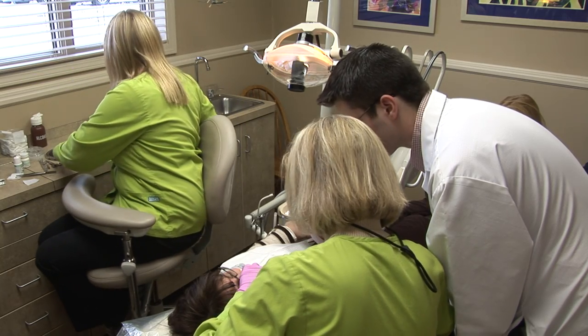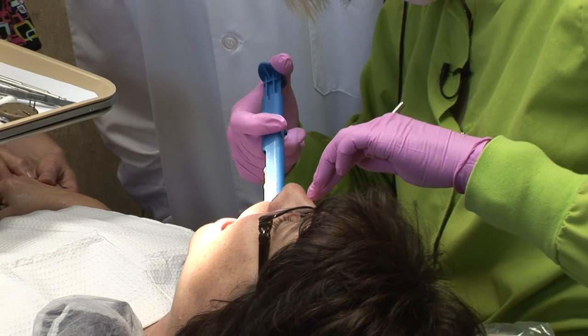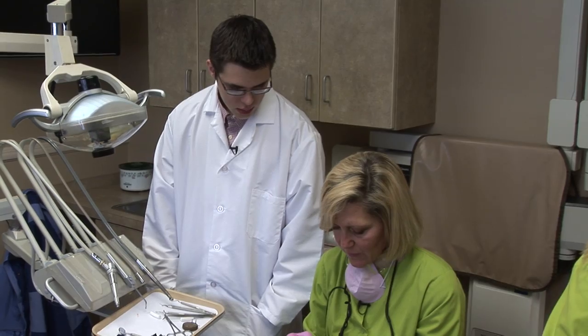I'm going to squirt this impression material around the tooth. It's going to set up like a firm putty in a little bit. That's perfect.